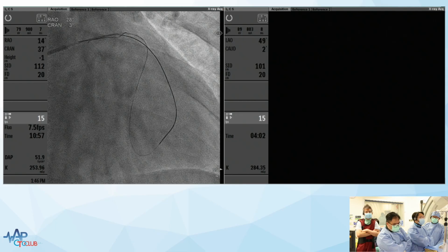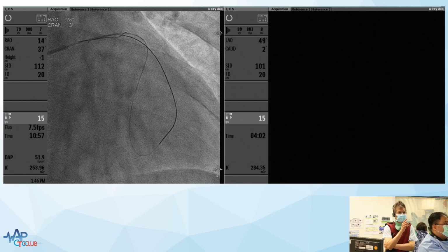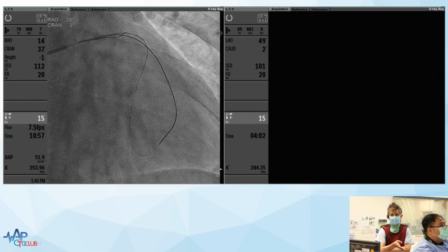Yes, I think I agree with you guys because Scott has made a very good point. This channel is a very small septal to septal. I don't want to push retrograde, so I want to convert to antegrade. Now, if I can convert to antegrade with tip in with a single guide, I don't think I need a second guide because the antegrade goes in and we can externalize to the antegrade system. As to checking with IVUS, that's difficult because a wire, a microcatheter, and an IVUS is too much for 7 French.